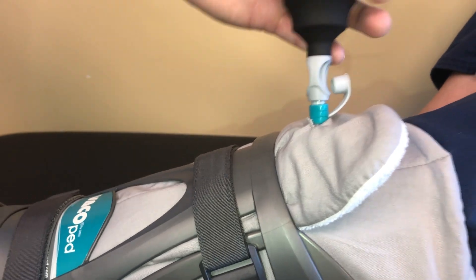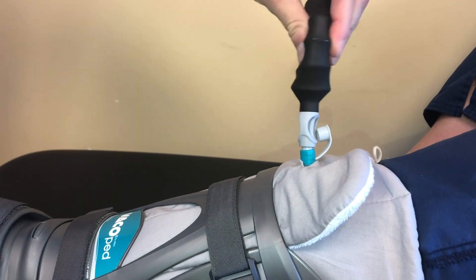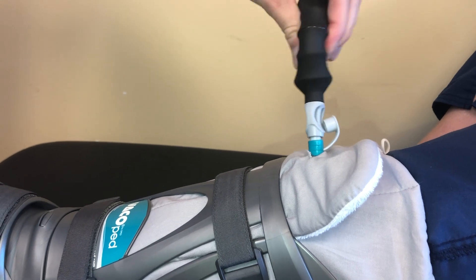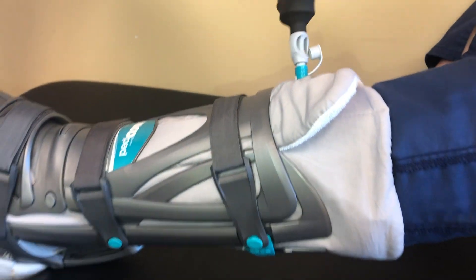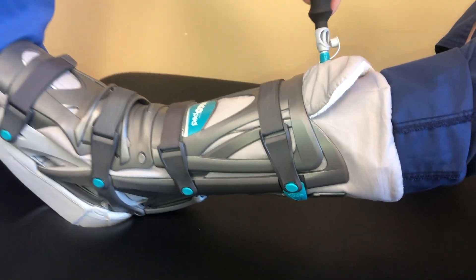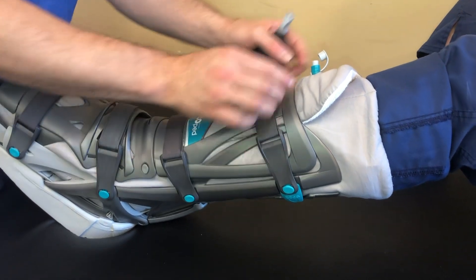This is the gray part. Next, squeeze the black portion of the pump several times until it no longer recoils. At this point, you may notice the liner is more conformed to your leg and no longer feels soft. Remove the pump from the valve, slide the valve ring portion towards your leg, and close the cap.